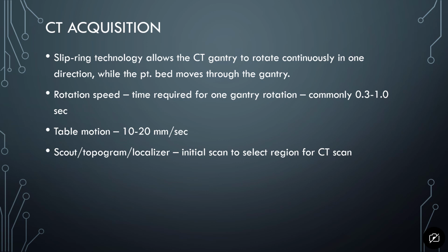This is commonly 0.3 to 1 second. The table motion correlates to the pitch, how fast the table can move through. And typically it's about 10 to 20 millimeters per second.